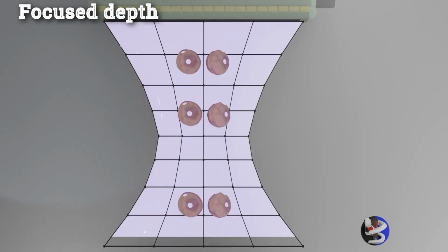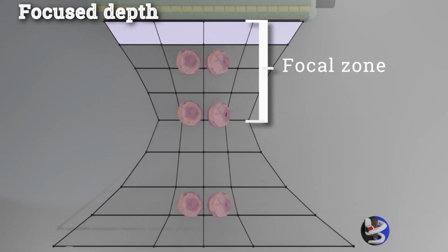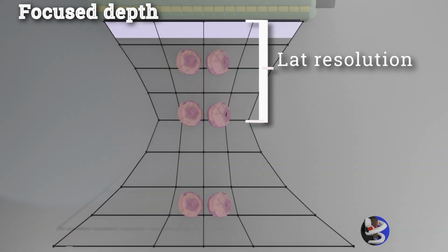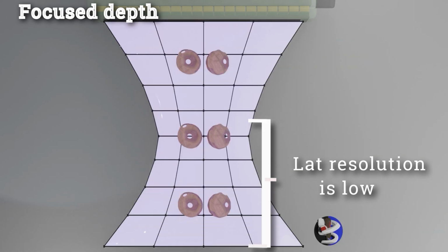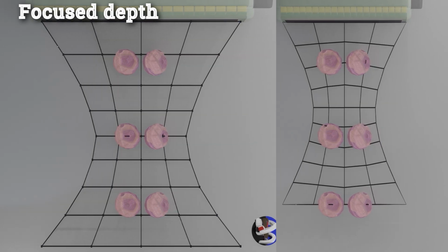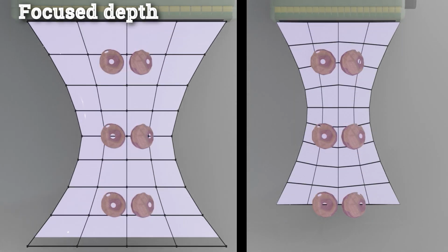The ultrasound beam is forced to focus on this selected depth with the narrowest diameter at this level, the focal zone. This causes the lateral resolution to be highest at this depth at the cost of worse resolution at the deeper depth. Axial resolution may or may not improve since this is determined mainly by the pulse length.